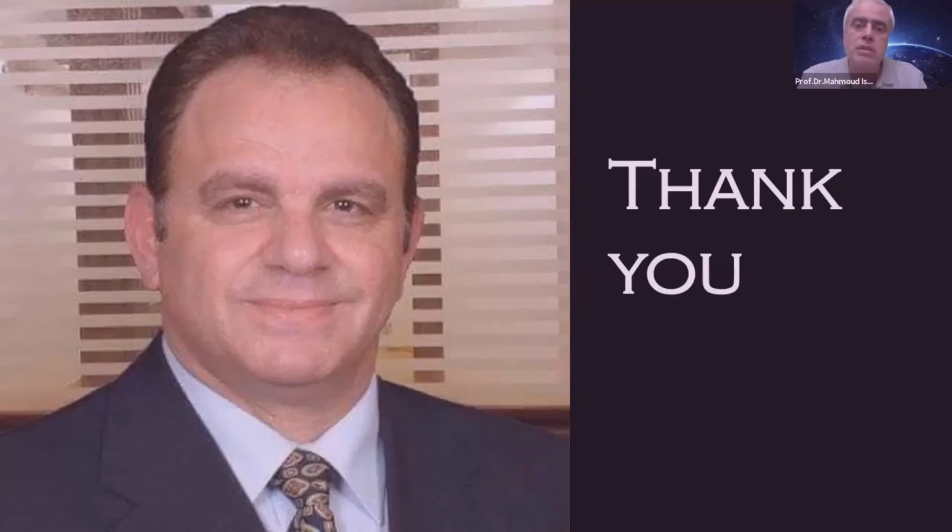I was in a debate with my brother and dear friend Professor Osama El-Mahrawy about PRK. He showed me that the British General Medical Council allows PRK until -8 diopters. So don't hesitate: once you have any doubt, go for PRK. Even up to -8 diopters, it's suitable. I don't do PRK up to -8, but it is viable and accepted.